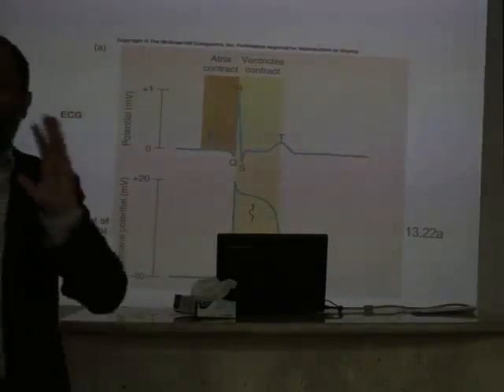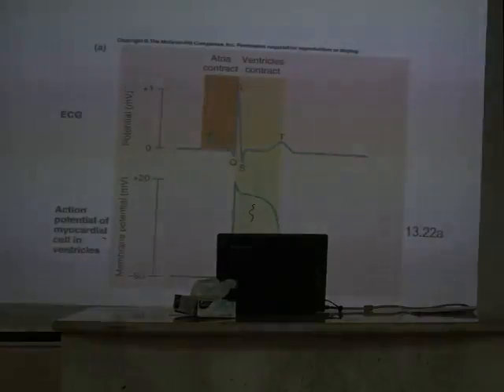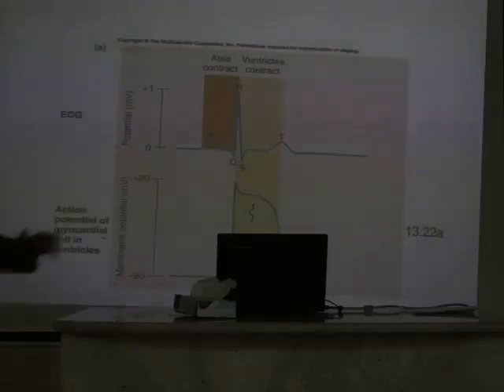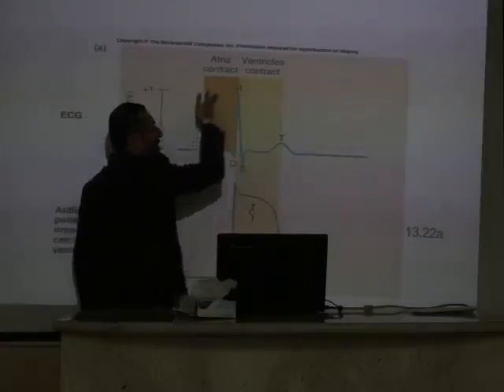So how many normal segments are there? Three. Can you name them? PQ or PR, ST, TP. Which one apparently is more elongated? TP, because there is a gap and then again the activity starts. Alright, so this is showing you the complete electrical activity of the heart.